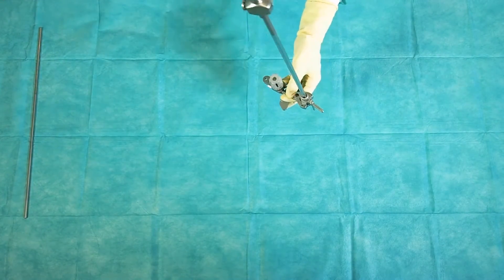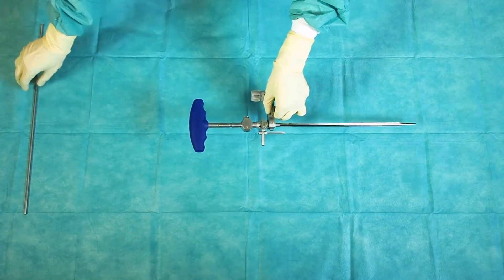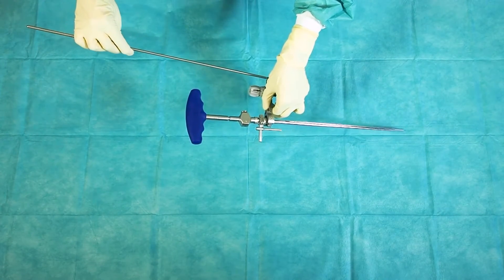The assembly is slided over the intramedullary rod. To check the assembly's alignment, an alignment rod can be used.